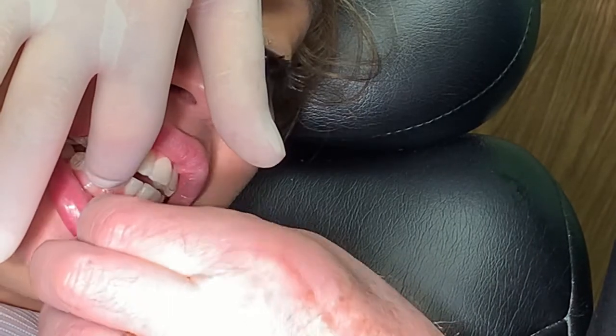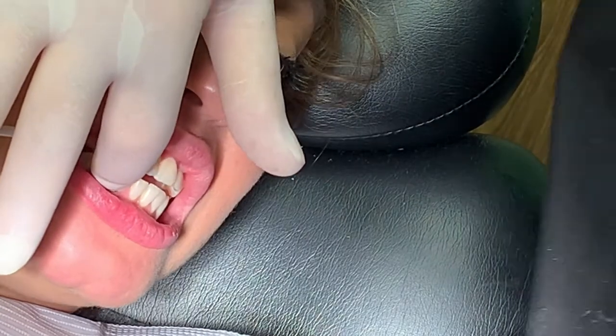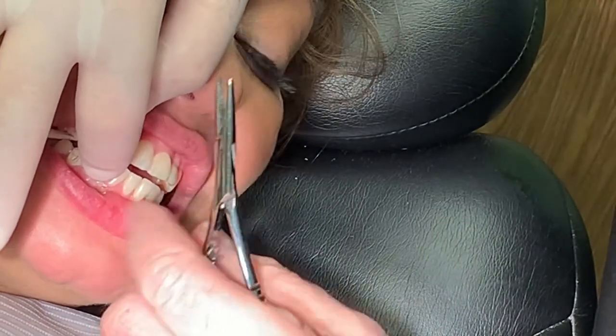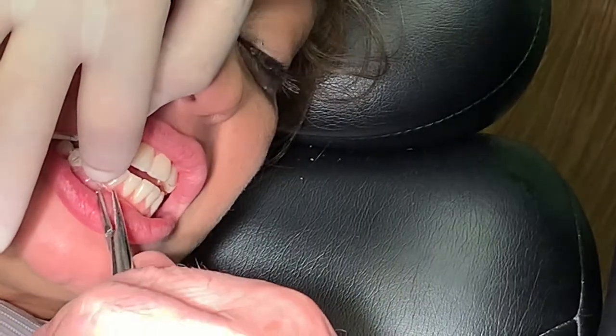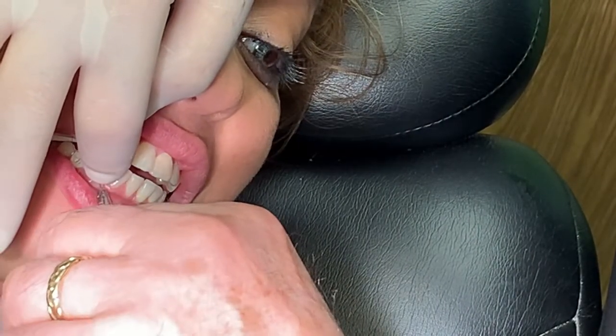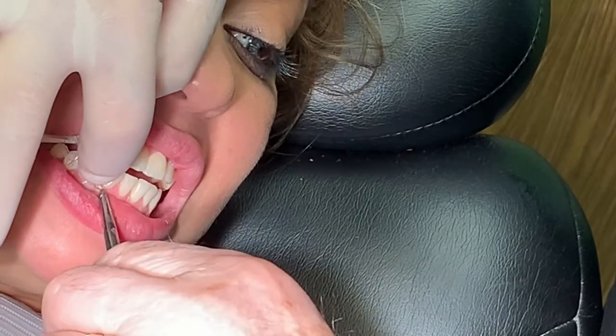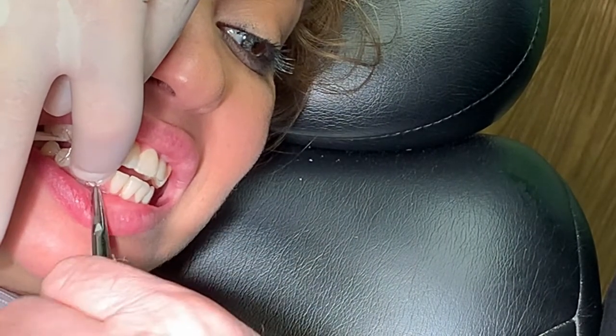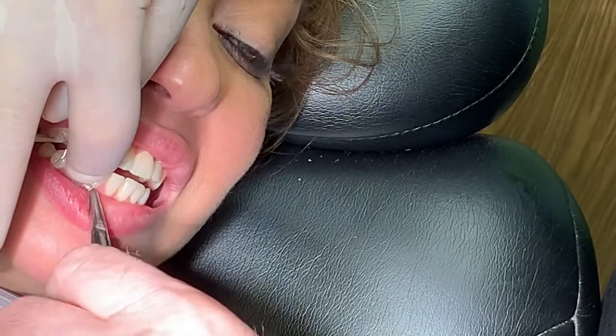And then you take your piece of wire, that little tail, and you start taking up the slack. Now I'm going to do this, holding your finger on the wires so that you can make a tail, a continuation of the tail that you made before.